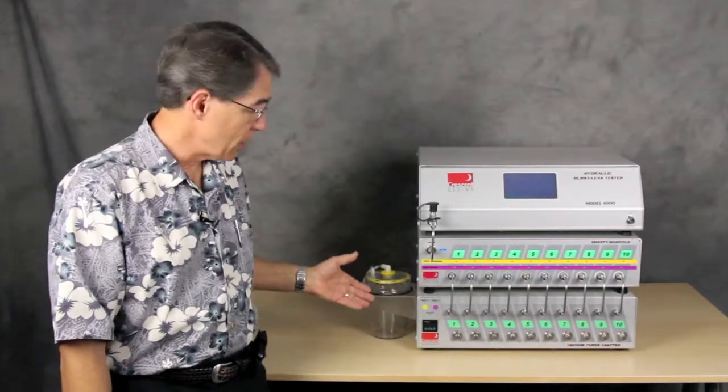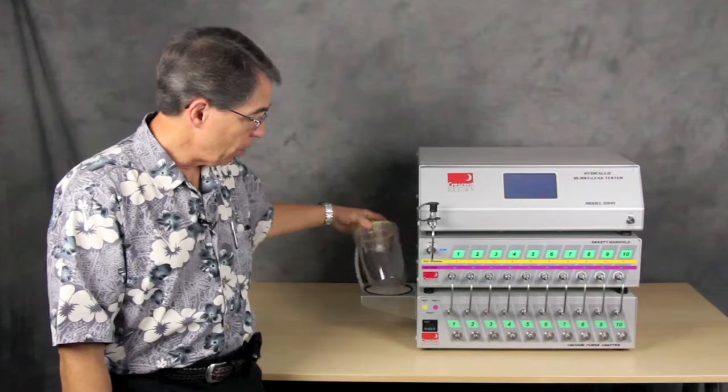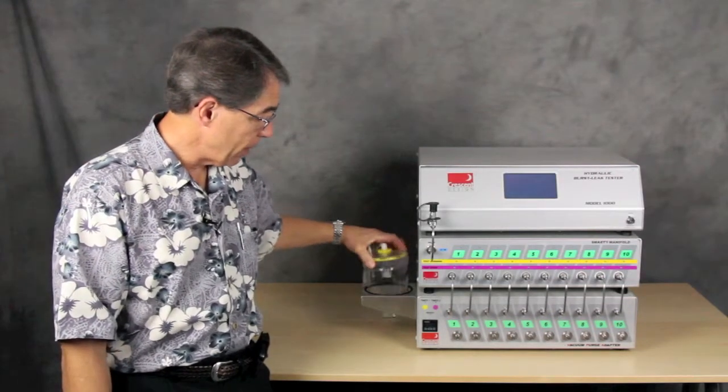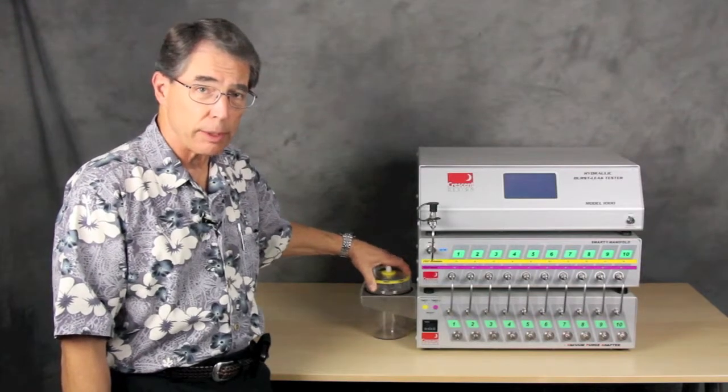So to start, we'll start on the left-hand side here. You'll see we have the vacuum reservoir, which we use to store the vacuum and any water that may be extracted from the product.